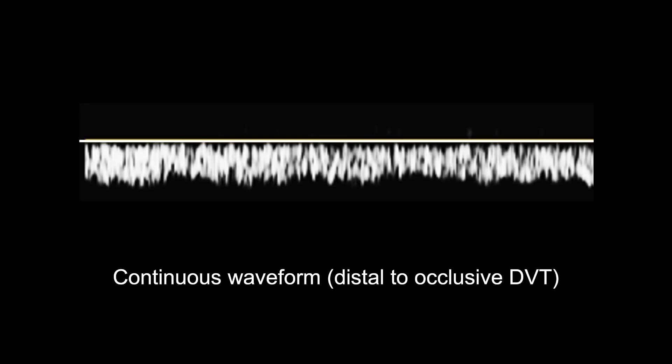Distal to a DVT that is either totally or almost totally occlusive, venous waveforms will be continuous. This means the waveforms will not return to the baseline with inspiration or dip below the baseline with exhalation, but will continue in an unwavering straight line below the baseline.